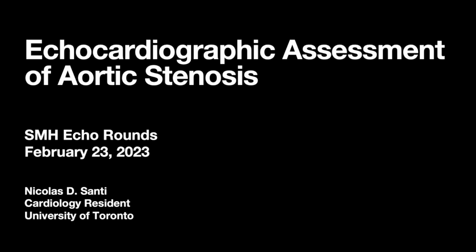Dr. Chow pointed out that in the vast collection there wasn't a recent talk on the basics of aortic stenosis, and so that's the goal of today's talk, to review a lot of the parameters that we use to assess AS.